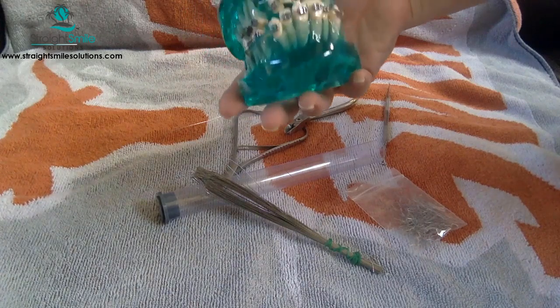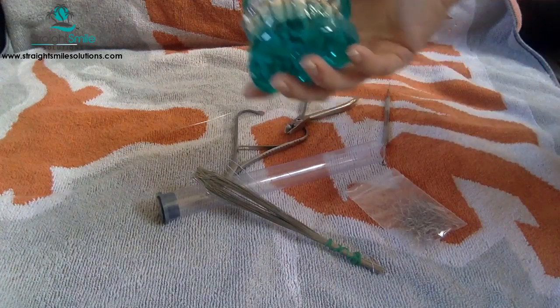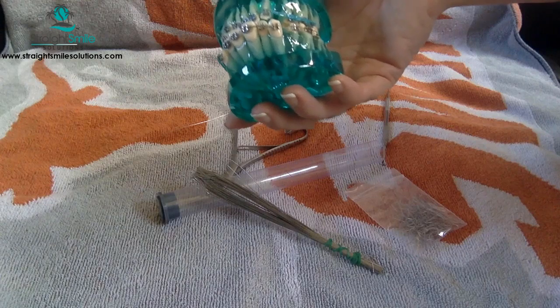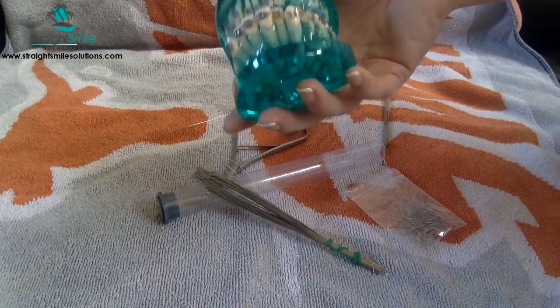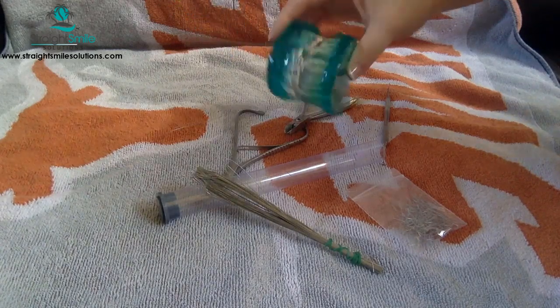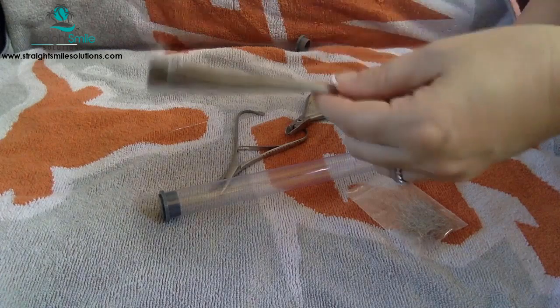It's really simple, very, very easy. Again, always check it with your glove to make sure it's not catching. Give the patient the instructions to tuck it back under with a pencil eraser, or you can give them a proxy brush or something else if they can do it. That's a little more hygienic. But that's it. We'll be going over another time how to do a lace back or long tie. That's a whole other video.